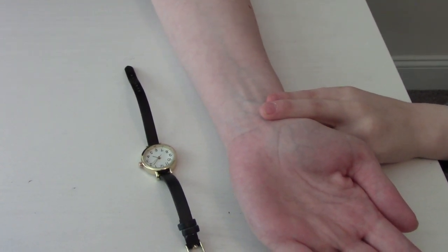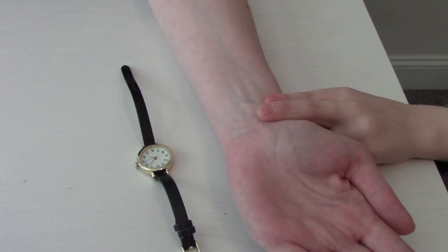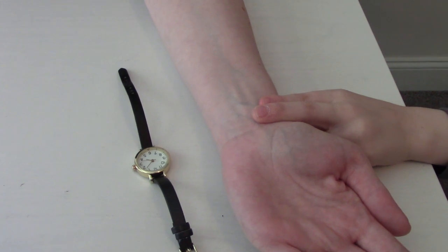The trick when it comes to taking pulse and respirations is you're going to leave your fingers there as if you're continuing to take the pulse. Take the pulse for 30 seconds and then check their respiratory rate for the other 30 seconds. You don't want to let the patient know that you're watching them breathe, because then they could breathe a little bit strange or they can alter their breathing or even hold their breath. So that's the trick on how to take pulse and respirations.